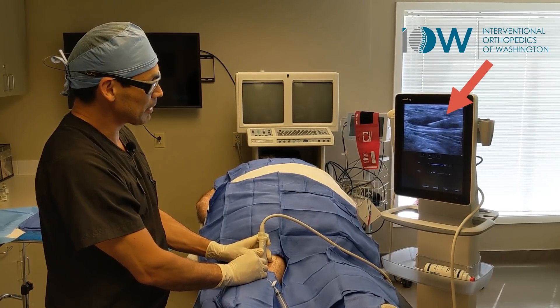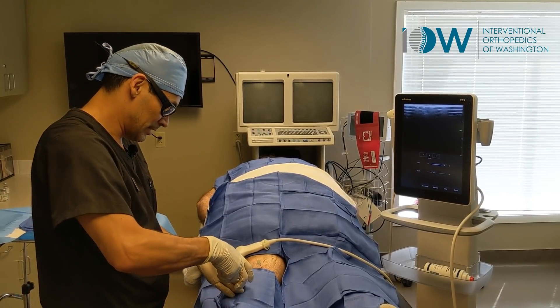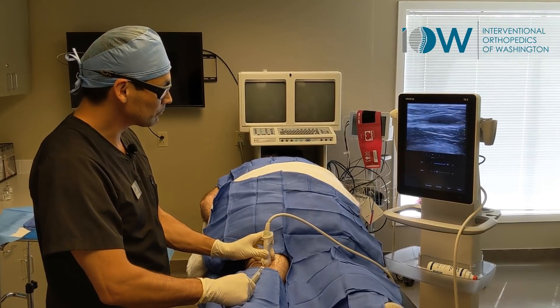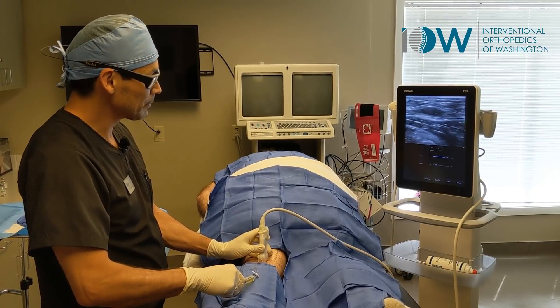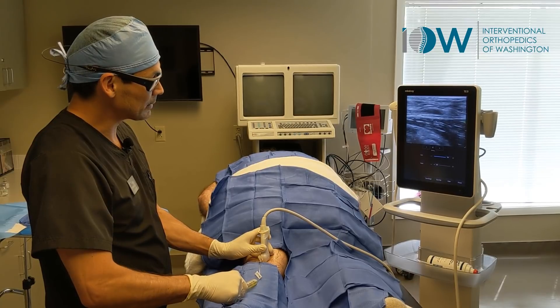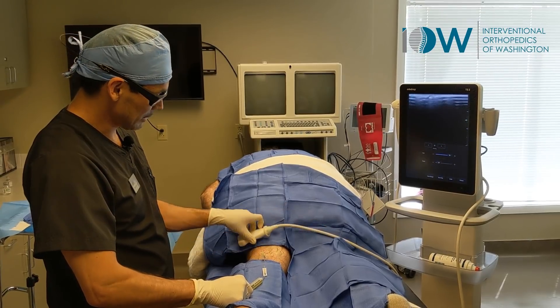You can see that needle goes directly into that pocket and starts to suck it all out. Here's our needle — that pocket is getting smaller and smaller, and after a little scan, looks like it's all out.